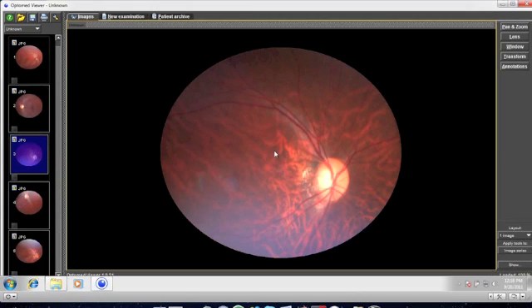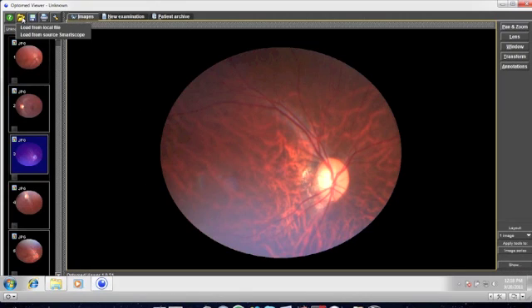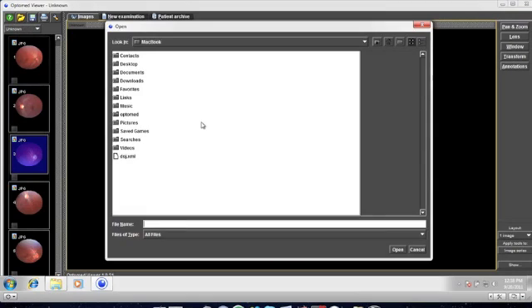The third choice is to view images already stored on your computer. Again, click on the folder image on the top left hand corner, but this time choose load from local file. Locate where the image is stored and click on it to load it into the software.